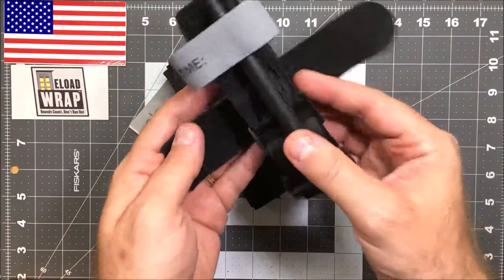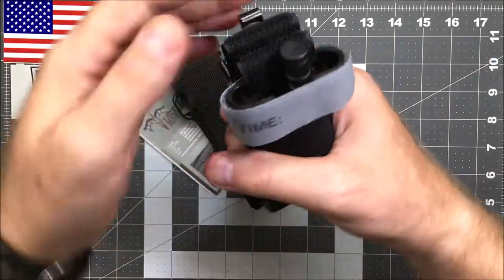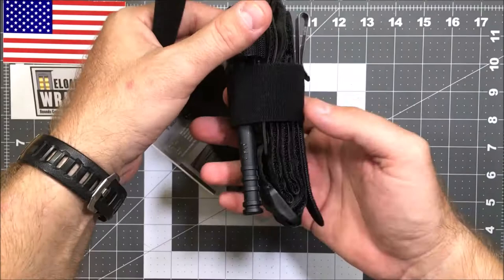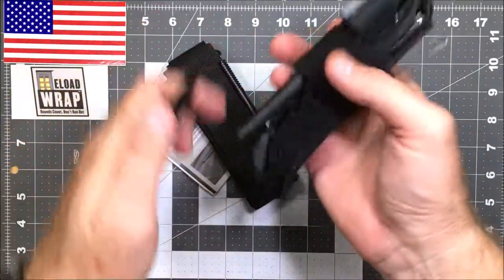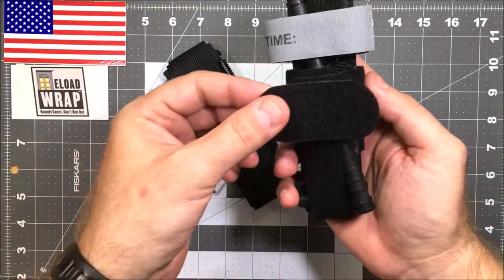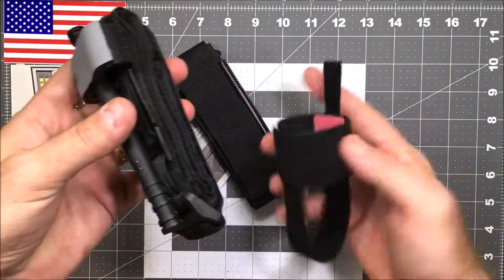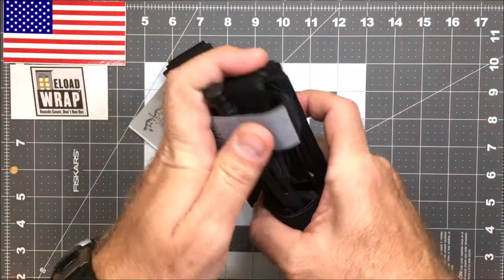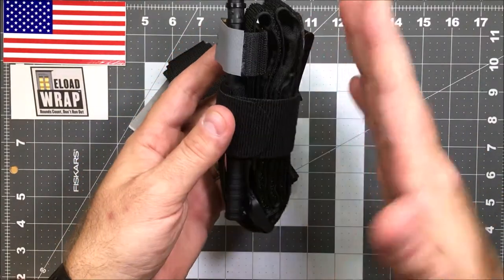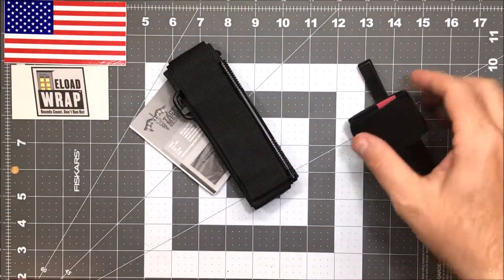The CAT can fit into a Reload Wrap rig. Here's the main body — we come around and put a loose fit on it. With the loose fit you can either use the top as the hold and bring up the bottom with the extension straps. Then take some caps, put the caps on it, and essentially you have the tourniquet fitting in here. The benefit is that it gives you a clip so you can clip it on. However, I consider this way too big for EDC.